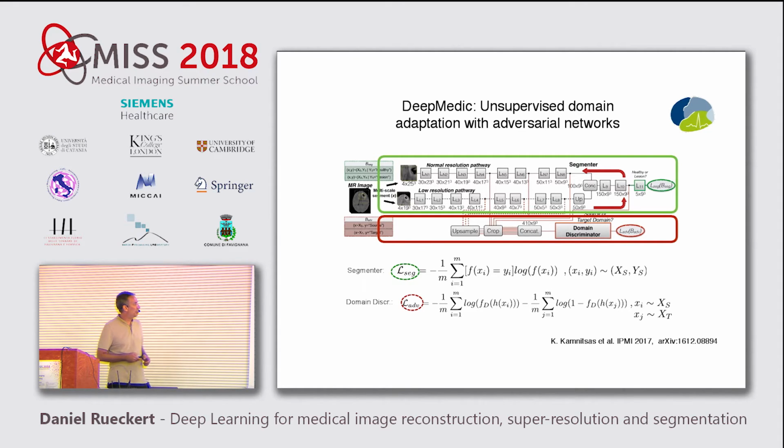which means I would like to have a good segmentation. So if I backpropagate my error from the standard loss function, my cross entropy, and I backpropagate my errors from the domain discrimination, they will go through the entire neural network, also through the branch which deals with the segmentation.